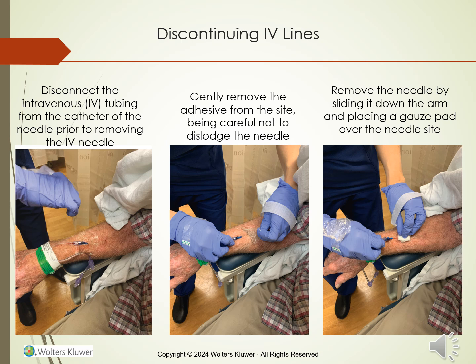I always want to ask my patients as well if they take any type of blood thinners. Patients who take blood thinners on a daily basis tend to bleed a little bit more. Their blood doesn't coagulate as quickly, so they may bleed through a gauze pad pretty fast. So you may need to use what is called a cohesive bandage, which is like a wraparound bandage, just to create like a small pressure dressing so they aren't walking down the hallway and then their arm is starting to drip blood.